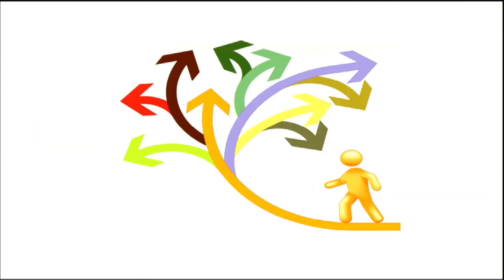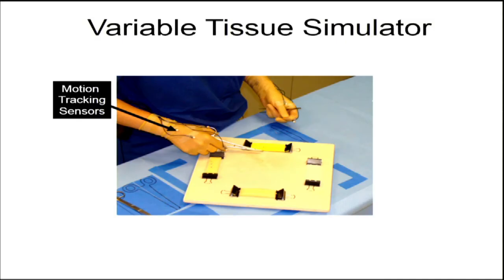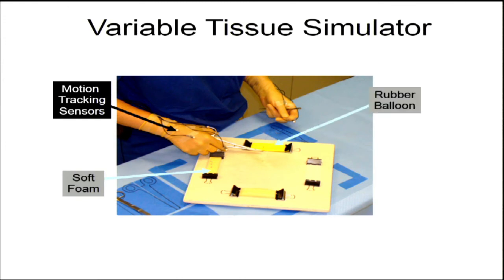And I think the question is, what does this still mean in terms of performance? Where do we go from there? And what I did again, which is my favorite thing to do, is start with the basics so that I can understand where we go next. And this is one of our experienced surgeons who has some motion tracking LEDs on a surgical glove, and we're having her do a simple suture. But what I did was a little bit of trickery in that I gave her 3 different tissues to operate on. One was a balloon, the other one was soft foam, and the other one was toilet paper.